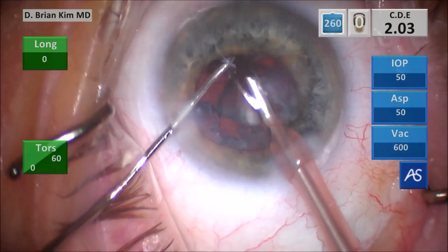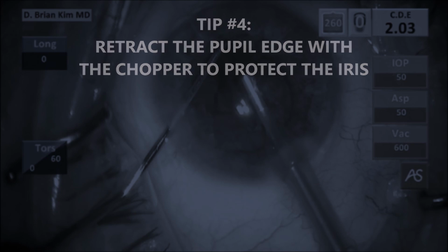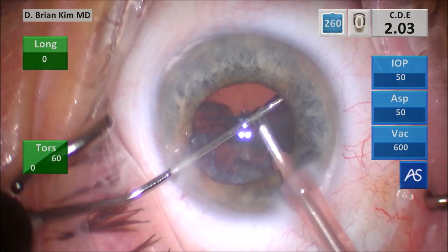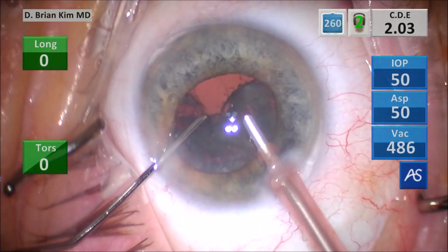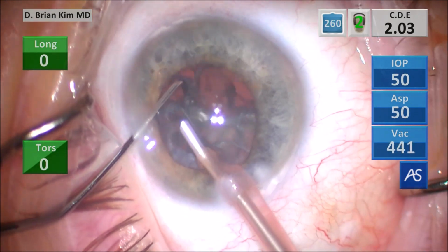And this is the final tip, tip number 4, retract the pupil edge with the chopper to protect the iris. The chopper can hook lens pieces up, it can chop and crack and divide lens pieces, but you know what? You can use it as a shield to protect the pupil as well. And so you're going to see right here, I'm going to retract the pupil edge right here, and I'm able to get closer to the lens material, which is close to the pupil, and be confident that I'm not going to grab the pupillary edge.